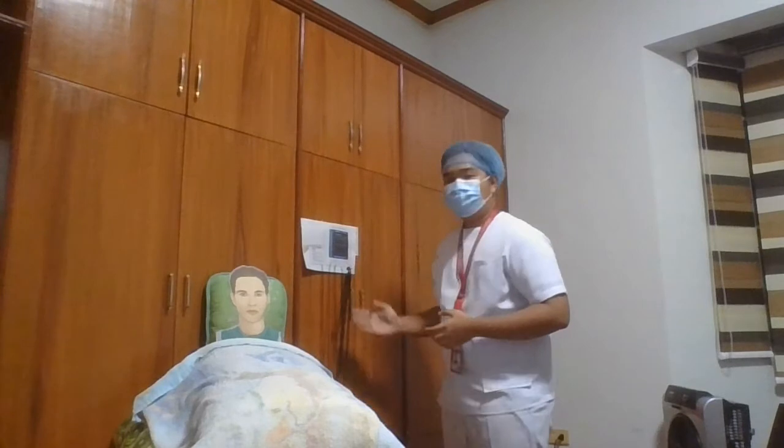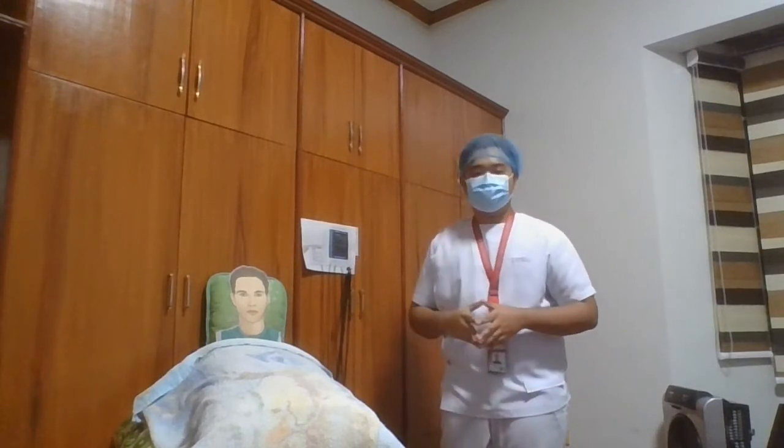And then after getting our patient's consent, we're going to assist the patient into the supine position or lying down. We're going to raise the level of the bed to a comfortable working height within our waist level. And then now we're going to position the EKG machine, the cables, and electrodes within easy reach. We're going to confirm that the EKG machine is electrically grounded, verifying that the third prong of the power plug — also known as the ground prong — is intact and connected into a power source.